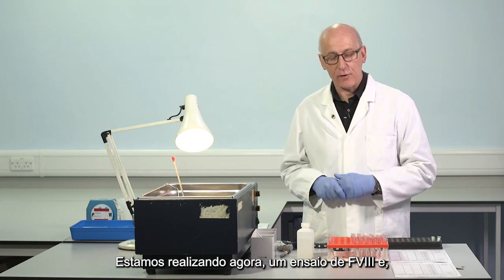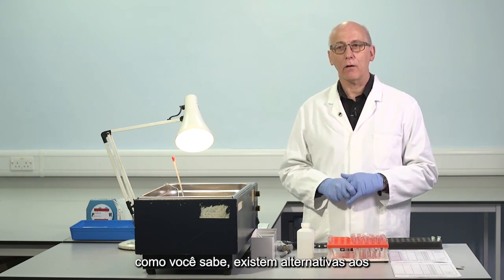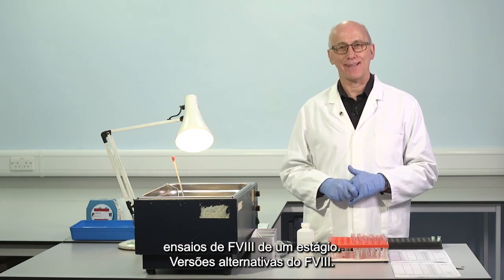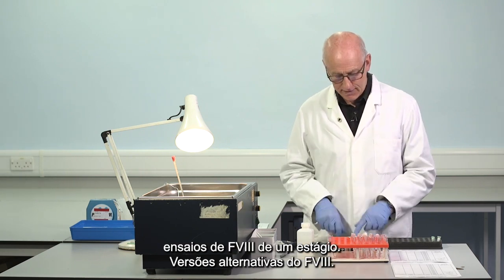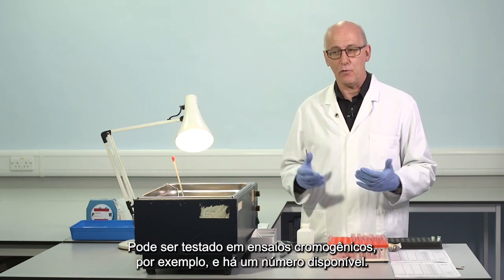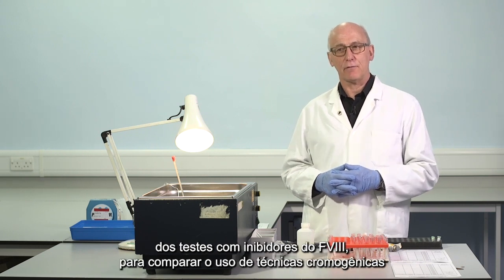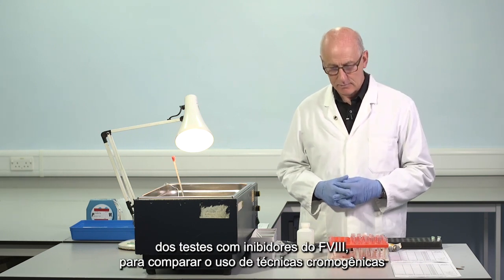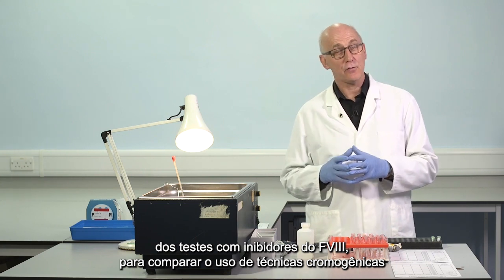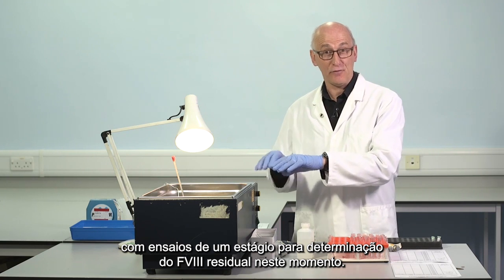Of course, we're performing just now a factor VIII assay. As you know, there are alternatives to one-stage factor VIII assays. It can be assayed in chromogenic assays, for example. There are a number available. Some studies have looked carefully at the results of factor VIII inhibitor testing, comparing chromogenic techniques with one-stage assays for determination of residual factor VIII.